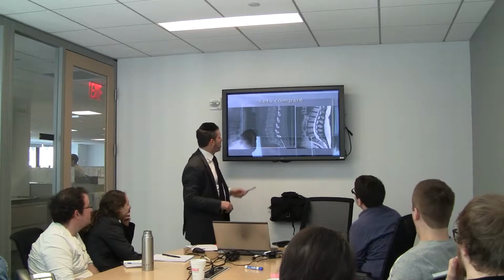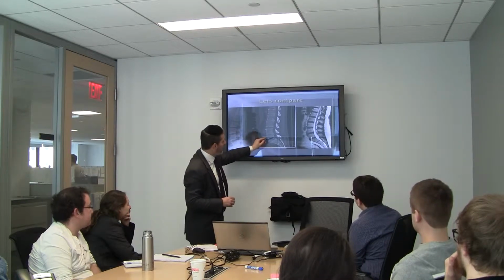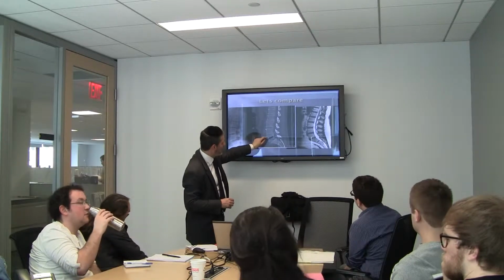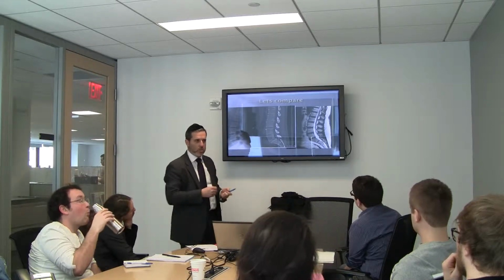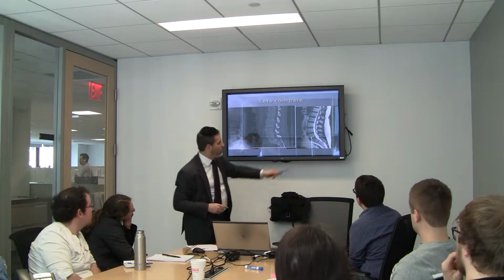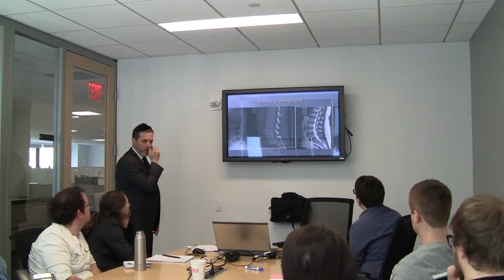We're seeing the nuances better. We're seeing some of the lineup of the spine. This bone is slightly in front of this, known as a slight listhesis. See, it's not lined up to this forward motion. And the MRI has given us overall the greatest detail. We're seeing the nerves here, we're seeing fluid, we're seeing fat. We don't have to infer as much, we can directly visualize.